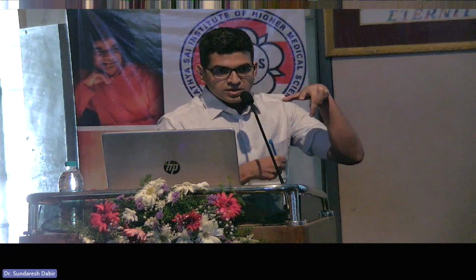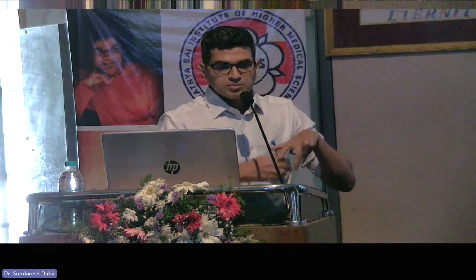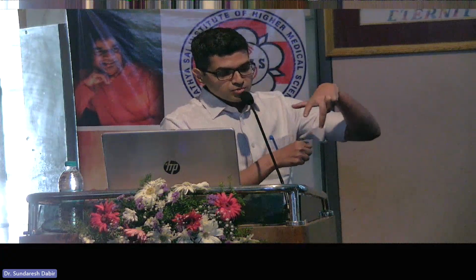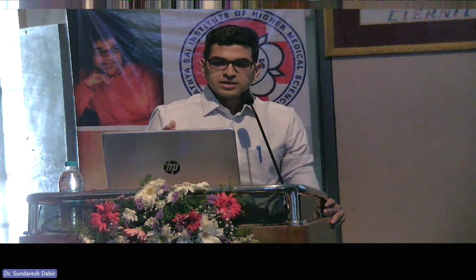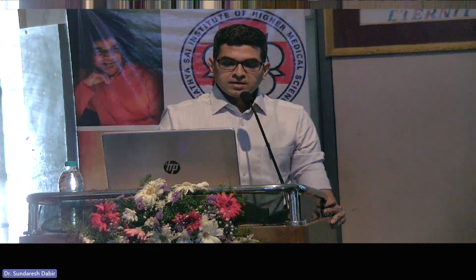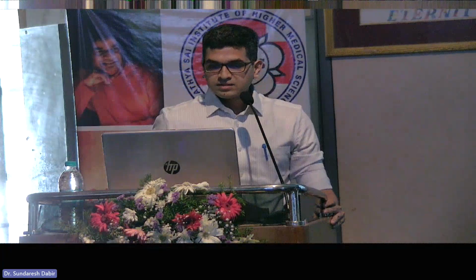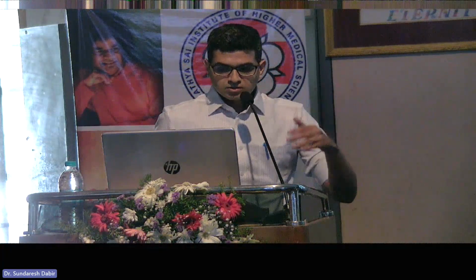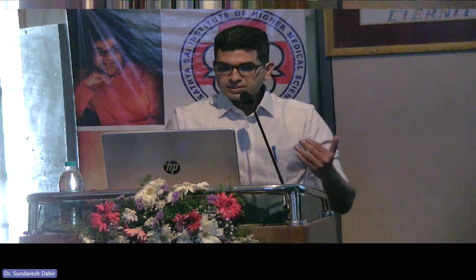So if this is your hand and you want to take a cranial projection, right? This is the LAD. So what you do is, I'm going to move my hand down, so the LAD comes straight. So that is the basic concept in cath imaging, that you will get LAD straight on in cranial views and you will get the circ straight on in caudal views. Okay.